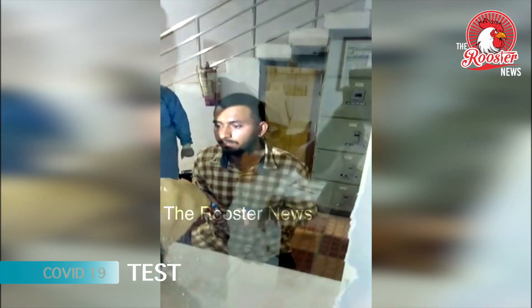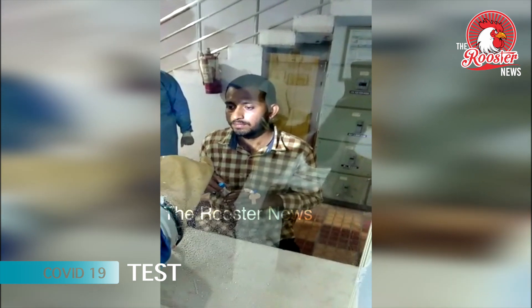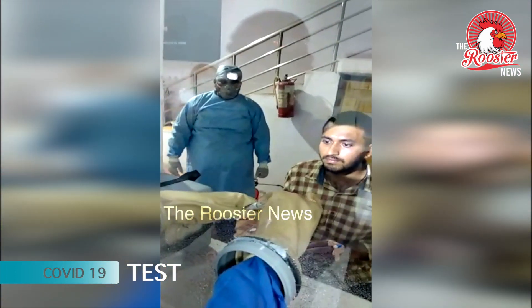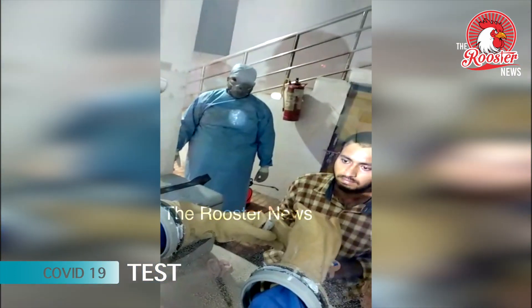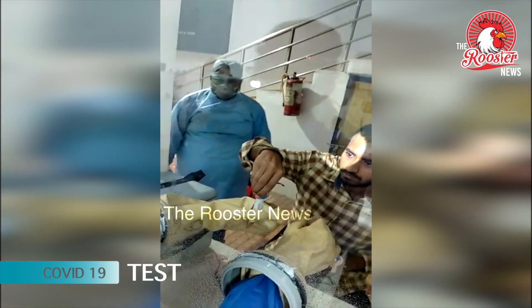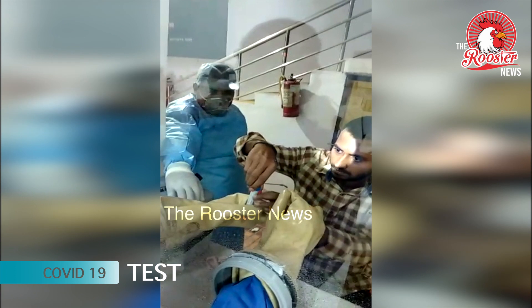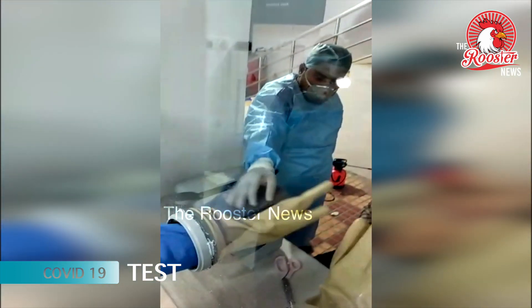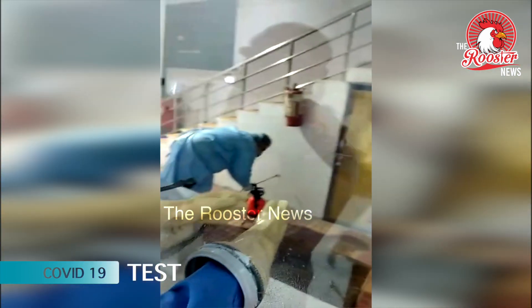He is opening the bottle, and the swab is introduced into the bottle having the transport medium. It is then being kept into the container having ice packs.